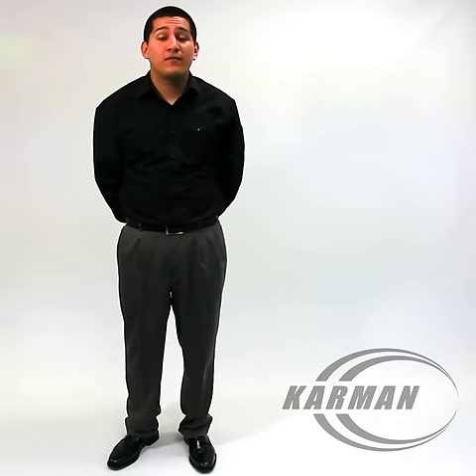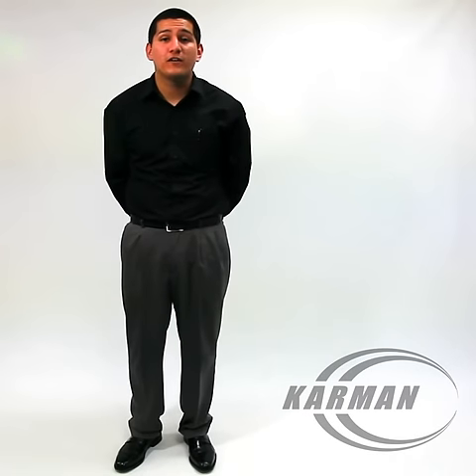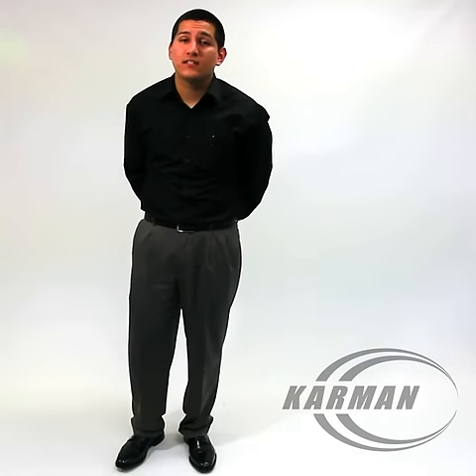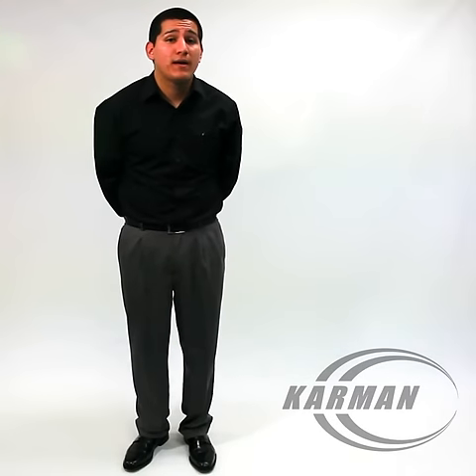Hello everyone, Edward here with Karman Healthcare. Today's transport chair I'm going to be talking to you about is our LT-1000HB. This is our aluminum frame transport chair, weighing in at 23 pounds.